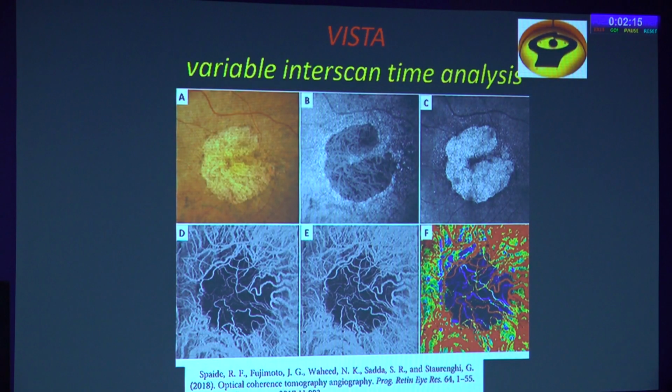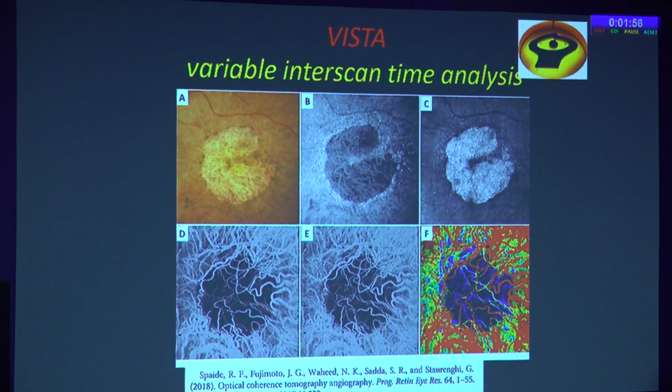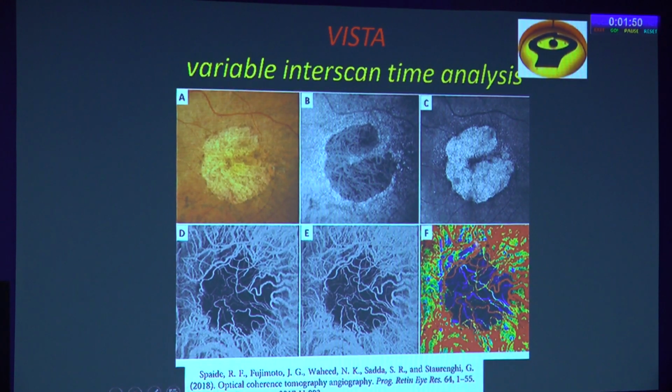Next is the VISTA, called the variable interscan time analysis. This is again a swept source OCT. That is a software algorithm. This is still not available in the market, but it is shown to show the blood flow in the posterior macula. What it does is it takes repeated B scans at 1.5 and 3 millisecond intervals at each point, and with the difference in these, it can show the blood flow rate. The area with the red has a good blood flow, whereas this one has a slower blood flow.